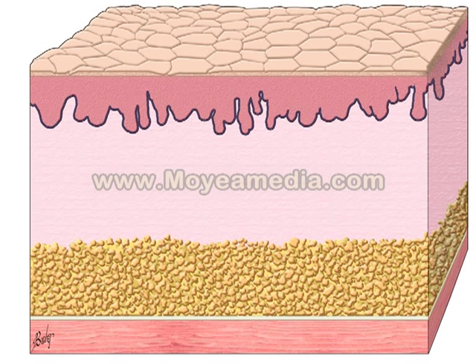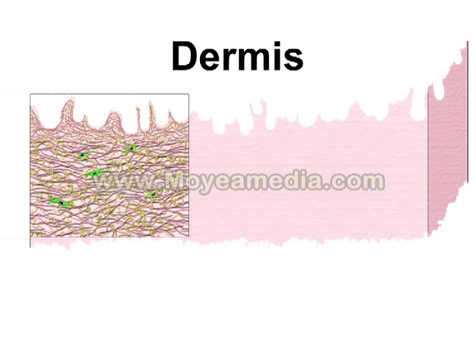Underneath the epidermis is the dermis, and then under that the subcutaneous tissue. The dermis is composed of collagen and consists of an upper, very loose papillary dermis and then a denser, bundled reticular dermis. The papillary dermis is noted extending into the rete ridge pattern, and below that the coarser bundles of the reticular dermis.